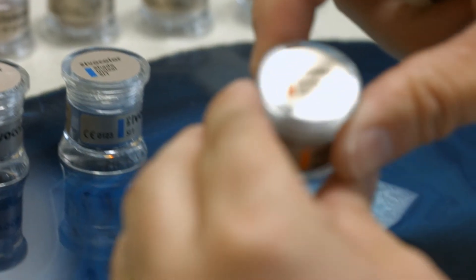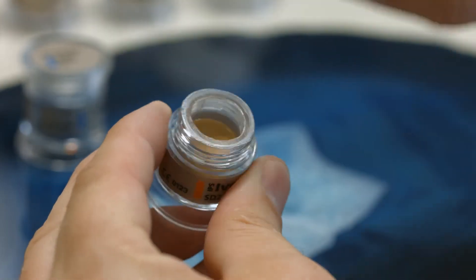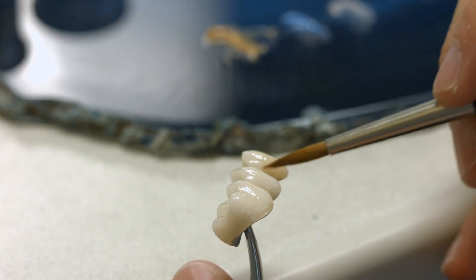Characterize and stain the restoration with IPS Ivocolor shades and IPS Ivocolor Essence powders using the standard layering technique shown in the corresponding IPS style video tutorial.